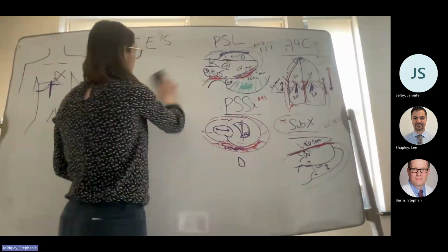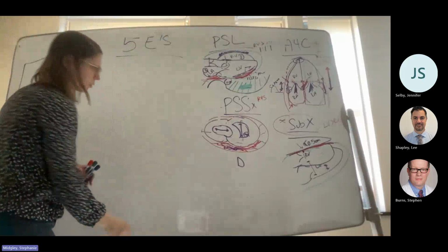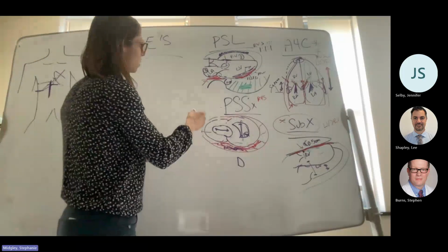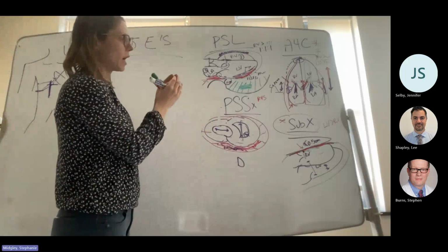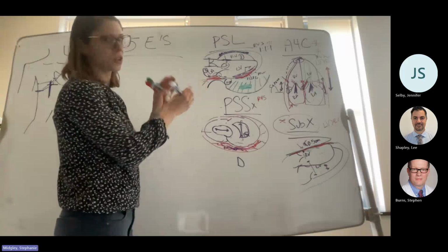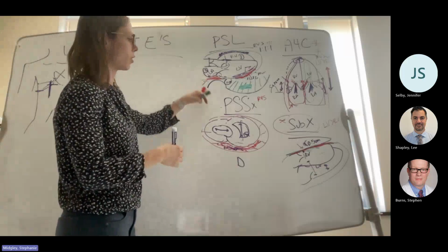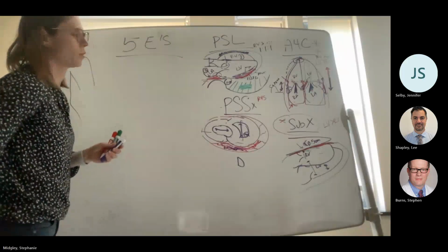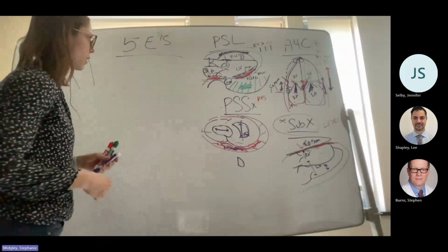There was actually also a case report that they just presented where the patient had an aortic dissection. The dissection, the aneurysm, was pushing on the pulmonary artery and causing external compression. Then they had right heart strain from the external compression, which is another thing that can cause right heart strain besides PE.